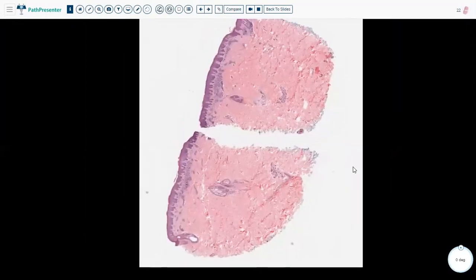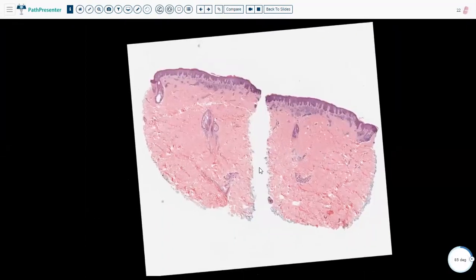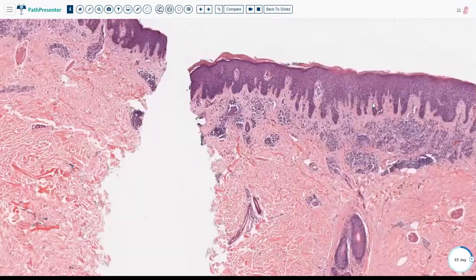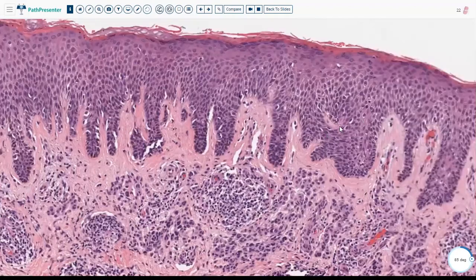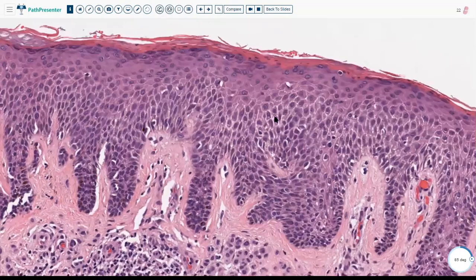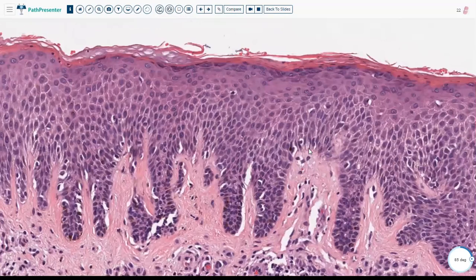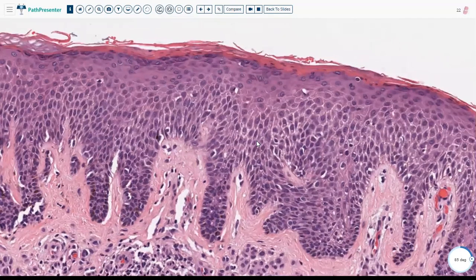Okay, so moving on to our next example. What we see here is a regular nevus. So nothing very interesting, but if you remember what we talked about in our previous lecture, what do you see here in the epidermis? Can anyone tell me very quickly? Here between the cells. Let's not focus on melanocytes. Let's focus on the keratinocytes. Spongiosis. There's a lot of spongiosis.